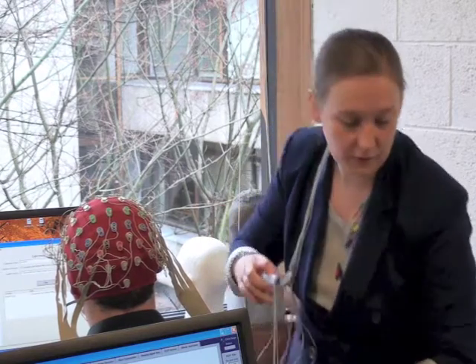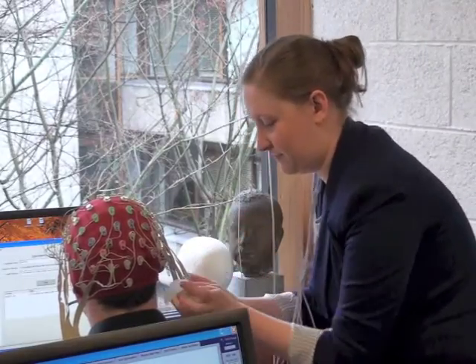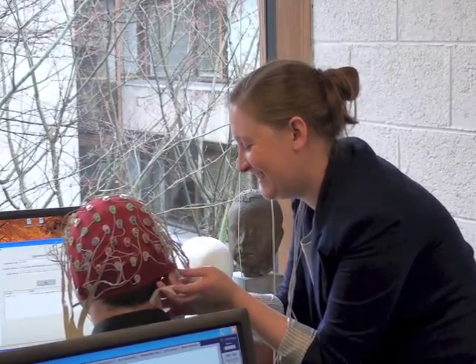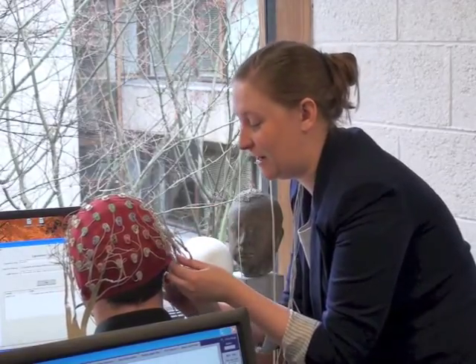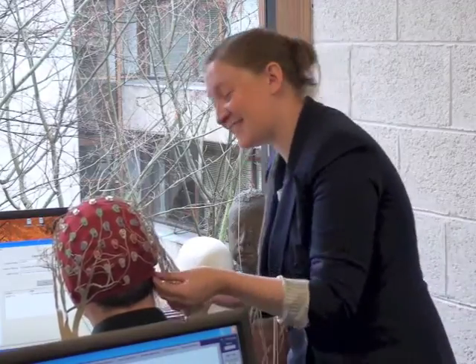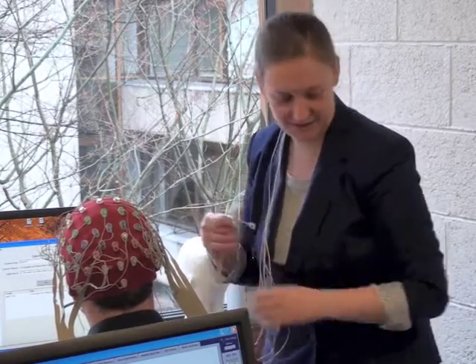So this goes on the left mastoid. You could be like Mary Fitzgerald and say, here's one I made earlier, and have someone who's already set up walking. So that goes there on his mastoid, and you put the surgical tape on, and this one does hurt when you yank it off because it's obviously on top of the hair. I usually let the participants take off those ones themselves after the experiment because it's not nice to do that.